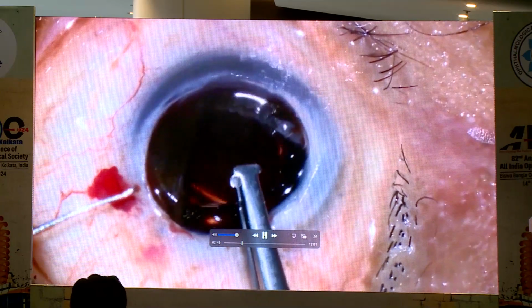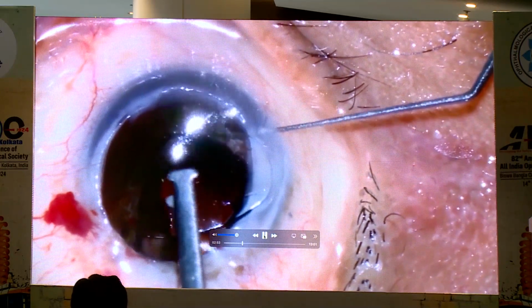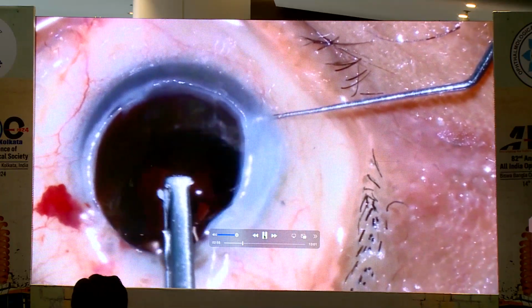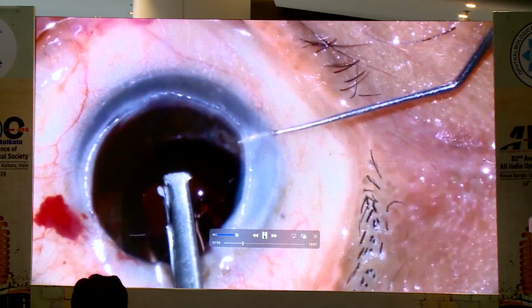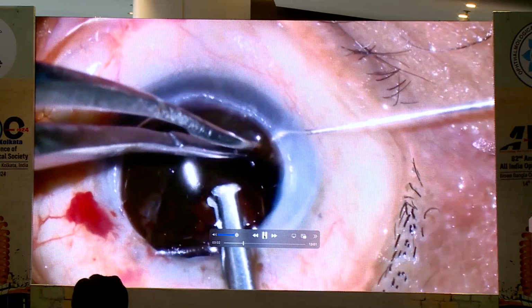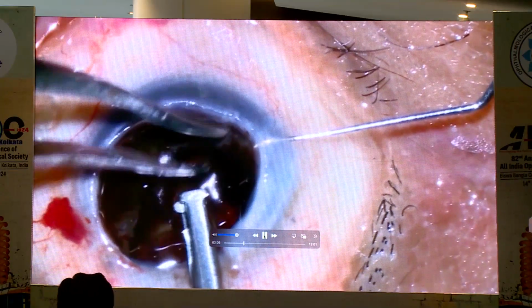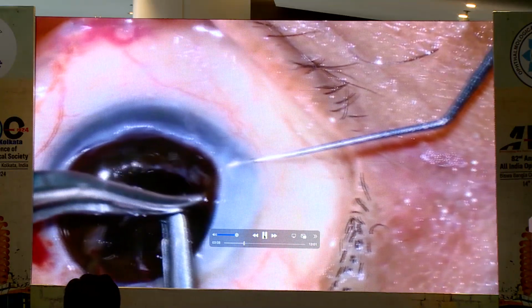It is an avascular place, and the lens is very stable. I have followed this case and nothing is going to happen. If you enclavate it properly the first time, in the future I have not seen any case in which dislocation of the lens has taken place. Only if you learn the real technique can you manage even this kind of condition.